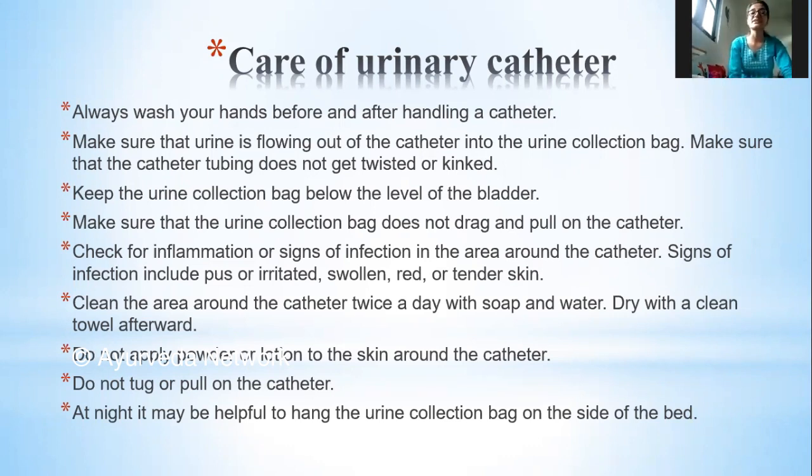That is why we are having this hand wash and sterile things, because you should make sure that you don't introduce any infection to the patient. Now, after your patient has this urinary catheter, how do you need to take care of that urinary catheter? Of course, you have to clean the area around the catheter, and you have to clean the meatus. So how should you do that?